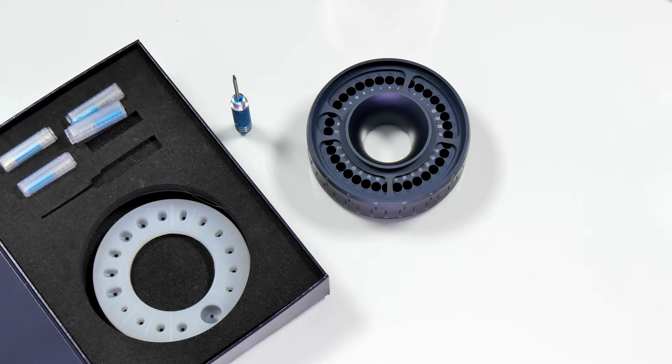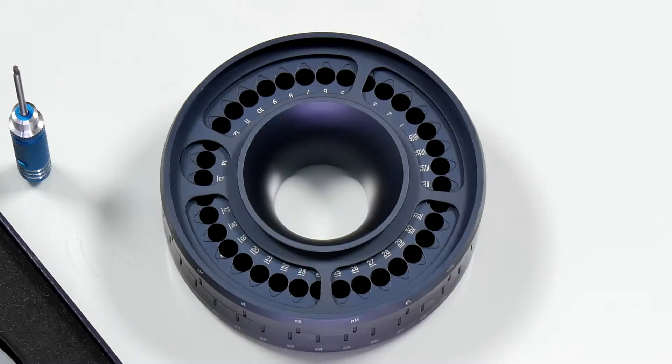If you look at the base of the mold, you will see 36 open sockets. These sockets receive the VPI prosthetic connection inserts.